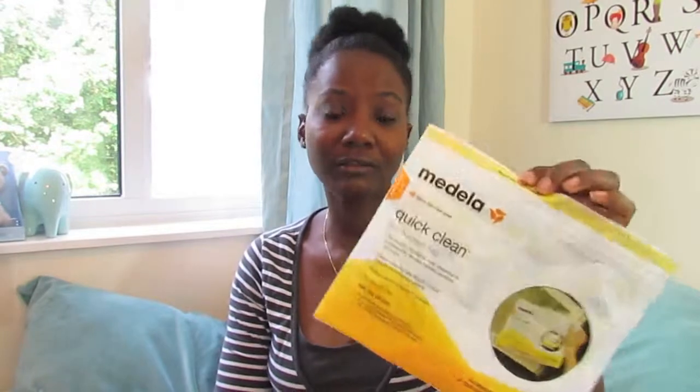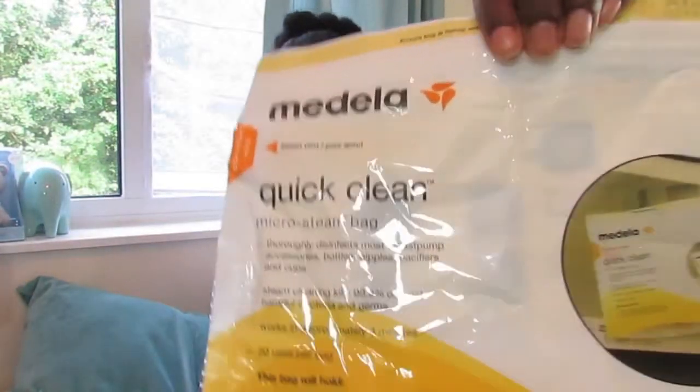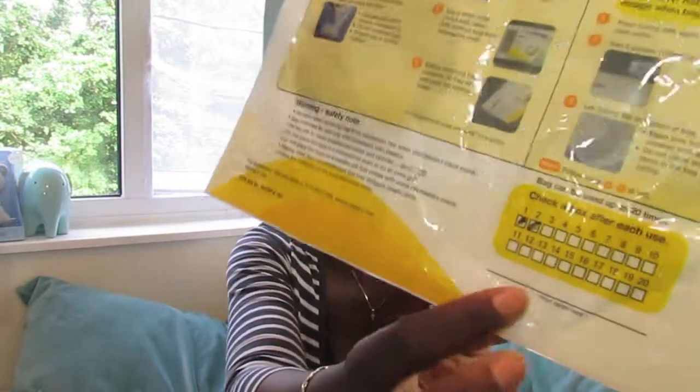I'll share how I sterilised things. I did try the Quick Clean microwave bags from the same brand — I got a bundle when I bought this off eBay, which gave me storage bags and some of these. I tried the microwave sterilise bag and it works. It has a thing where you mark off how many uses, because you can reuse them. For the hose, it recommends using the bag — you just put enough water just over the hose.